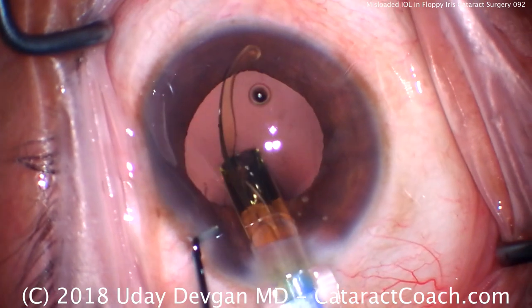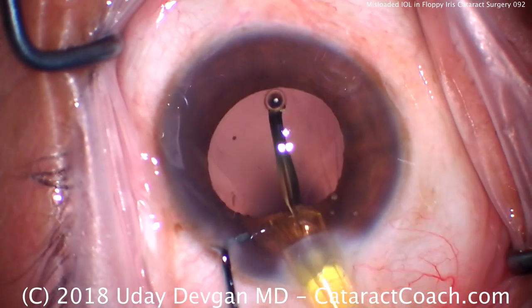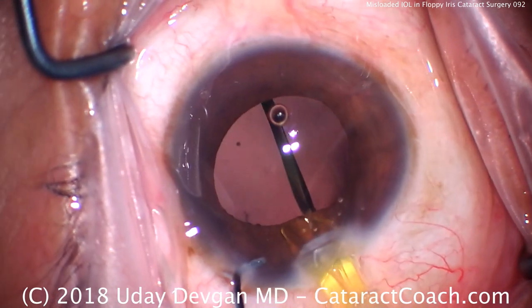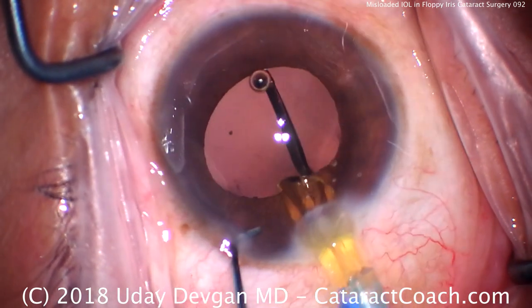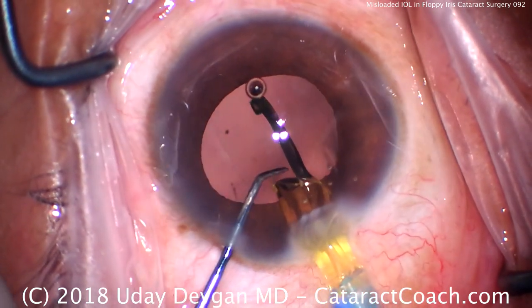Pause. Remember this haptic has to go in the eye in the opposite direction, so let's twist our injector hand. The haptic should look like an anti-S, not like the letter S.